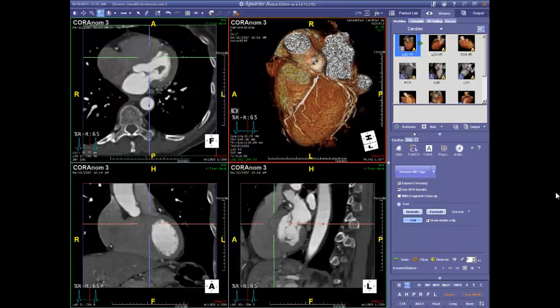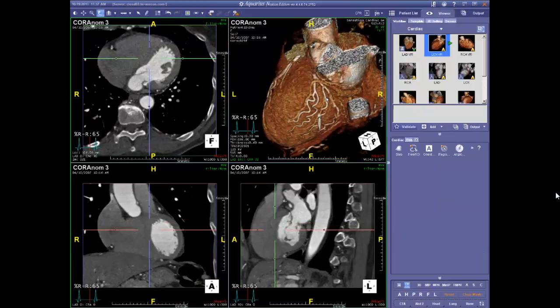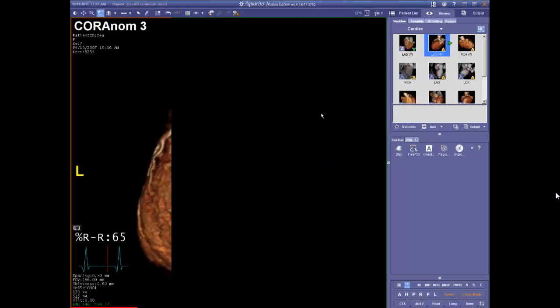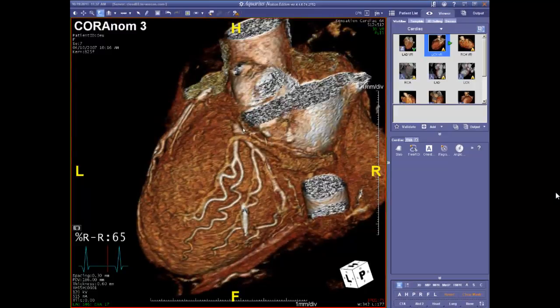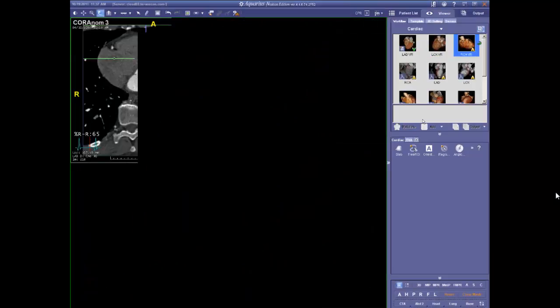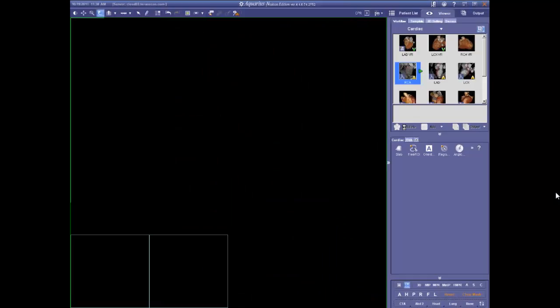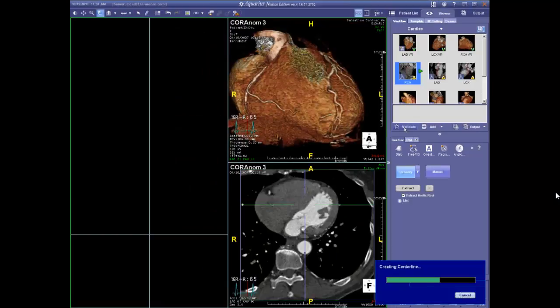We can use the various tools and I'll quickly validate this as the LAD here, the circumflex here. We've got a circumflex vessel - blow this up a little bit - far more complex than the others, but I think this is just one single circumflex that then bifurcates everywhere and has four or five branching vessels. Here's the right coronary artery. I'll validate that the right coronary artery is the abnormal one. It's still drawing a center line - let's let it finish. With good data these tools can actually speed your reading up quite a bit.